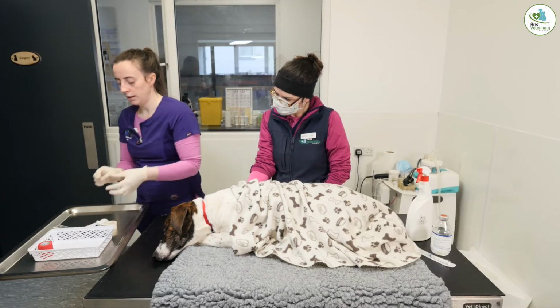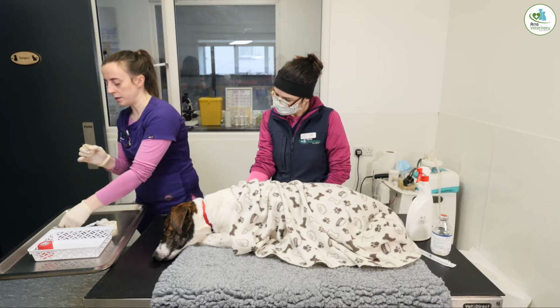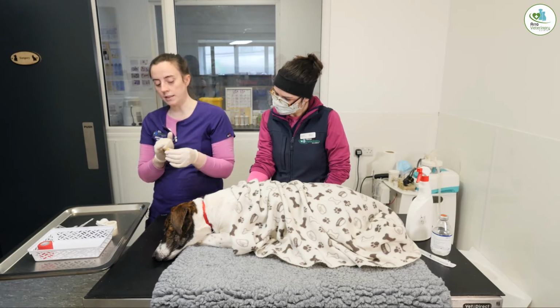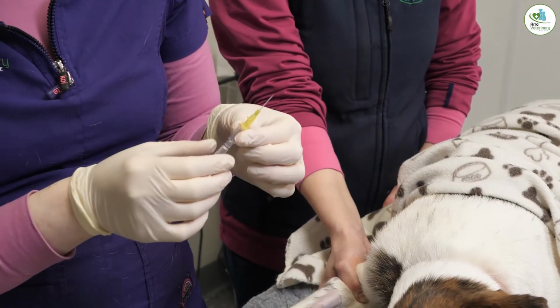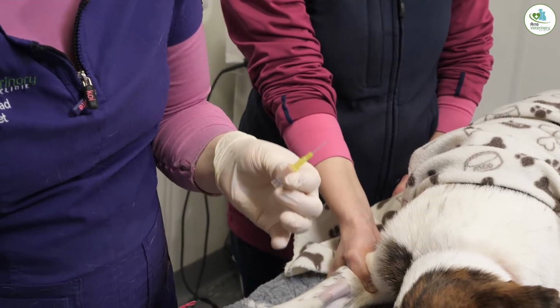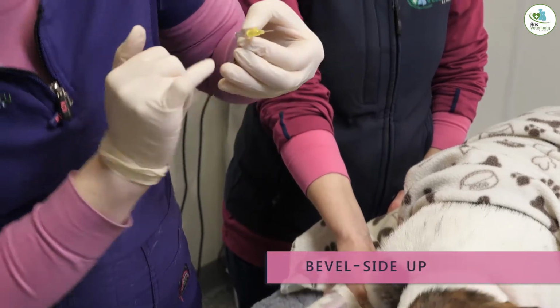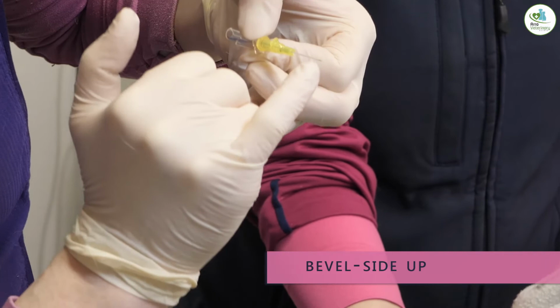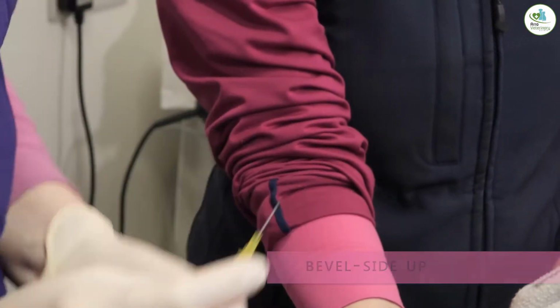Open it up. So with the cannula, there's winged cannulas and ones without wings. The one that we have here at the minute doesn't have wings. Normally we do get one with wings, they're handier to hold in. That's our bung then for it. So bevel. So on the cannula there's a bevel on it where the needle is. So bevel up. You want to go?